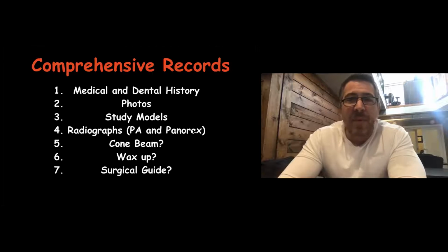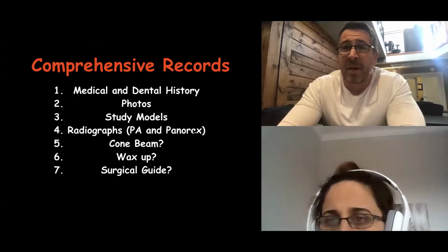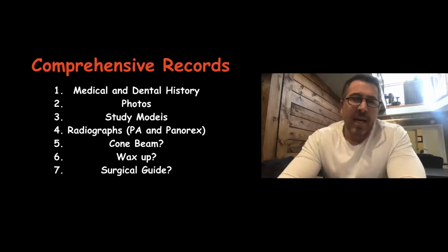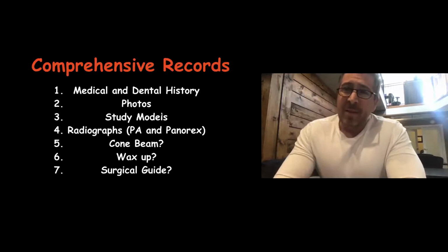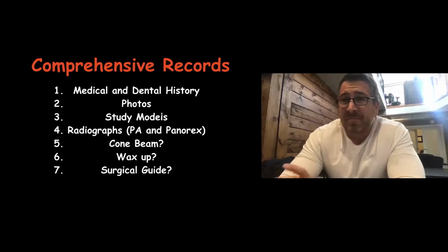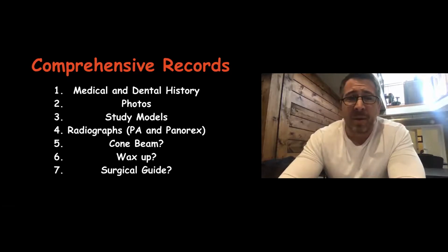I'm becoming more digital. We just incorporated a cone beam into the office. We've had an Omnicam for quite some time. We just got the Primescan. So I'm getting more into the digital side here, but I've been more of a bread and butter, photos, models, panoramics, PA, and study models, more of an analog dentist than a digital dentist. But the digital dentistry age is here, and we need to be on board with it. If you're not on board with it, you're missing the boat.